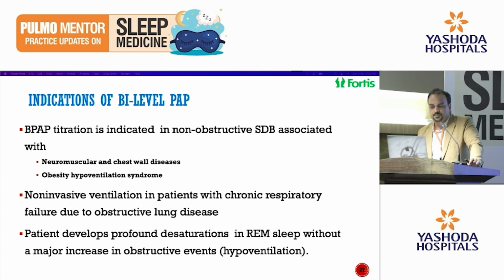These are the indications of non-obstructive sleep disordered breathing where BiPAP is of use, like patients who have muscle weakness in terms of neuromuscular or chest wall diseases, obesity hypoventilation syndrome. Although the guideline says that you start with CPAP, in India the scenario is that once the machine is purchased, it cannot be returned or replaced. So most of the time, these patients are candidates for BiPAP titration.